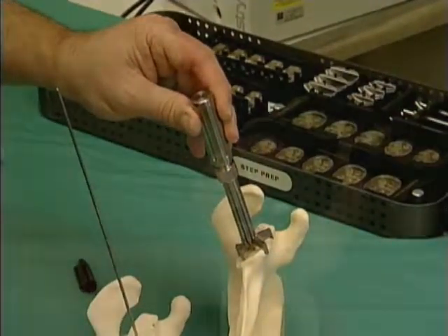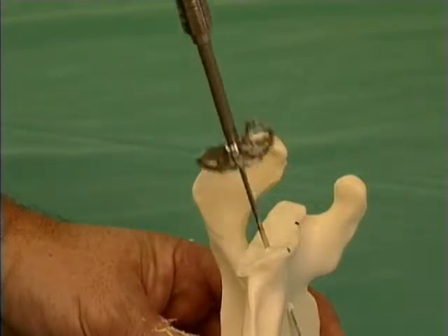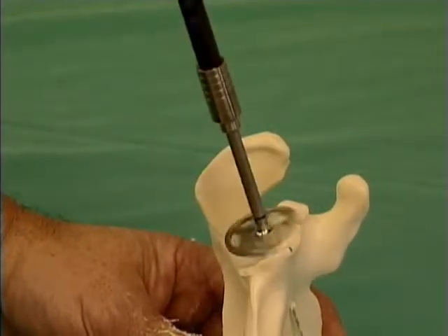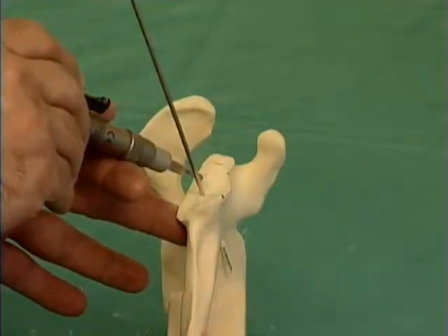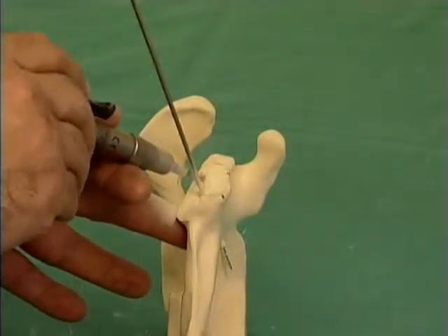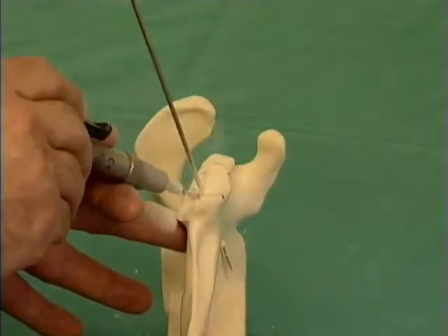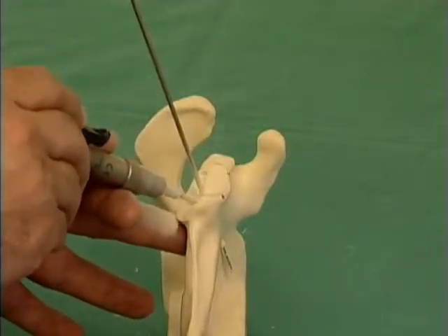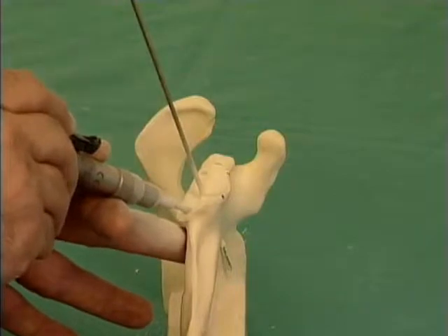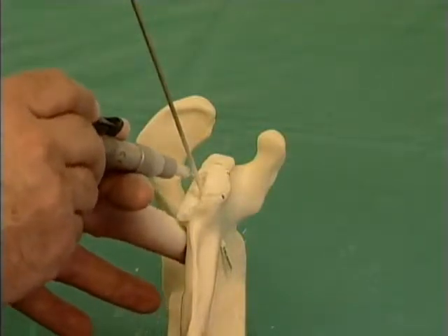The guide pin is inserted. The anterior glenoid is then reamed such that the anterior half of the glenoid is prepared. The posterior glenoid is then step cut with a bur, removing bone near the midline of the glenoid and tapering this posteriorly such that very little bone is removed.